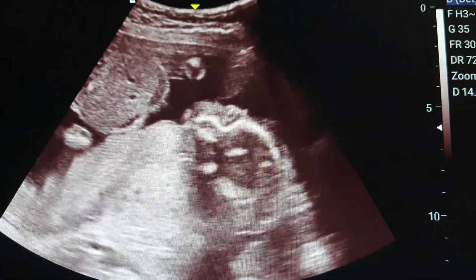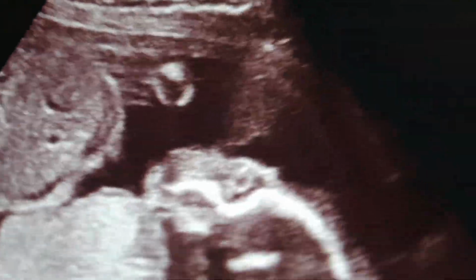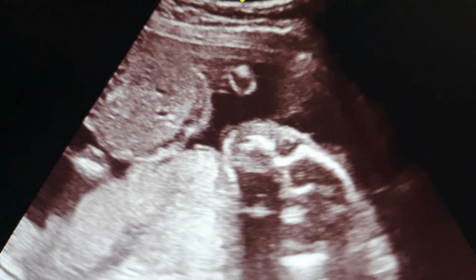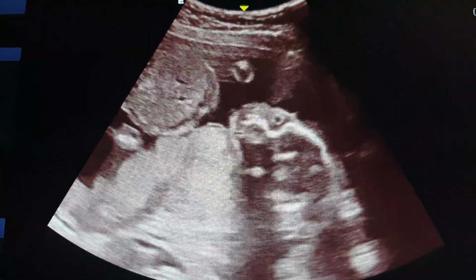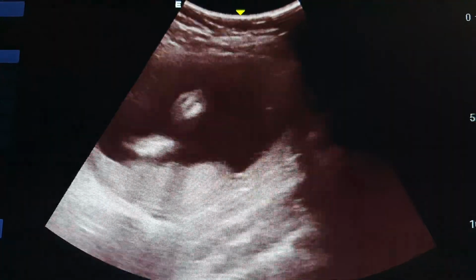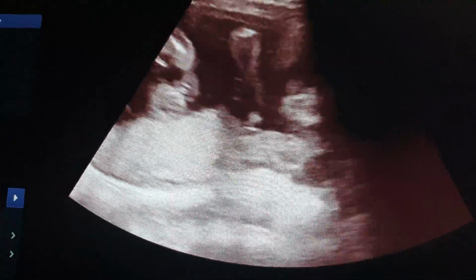especially if you're a radiologist and you want to have a picture. As you can see here, this is a part of a fetal limb, and if this is a bone, of course you have to rotate your probe until you reach the longitudinal section of the femur to be seen clearly, so you can measure it later. Please try to get good pictures, especially of the area of interest, because these pictures are very important in your report and actually express the comment you will write in your report.